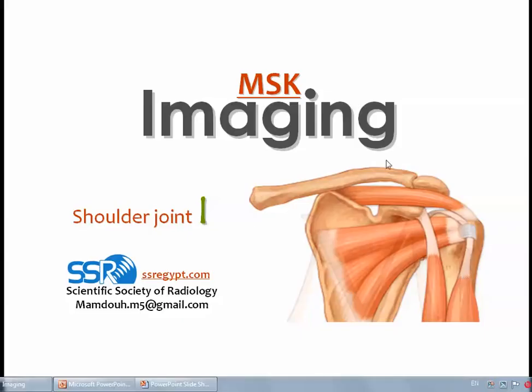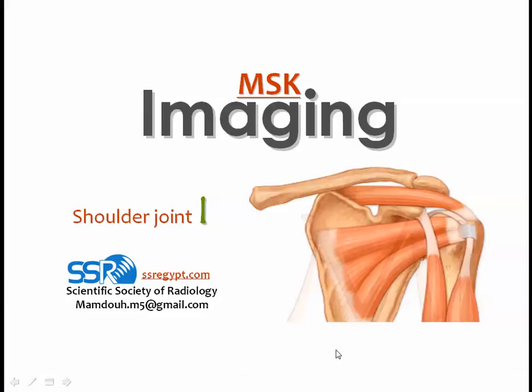Dear colleagues, in this talk we'll handle one of the important issues in musculoskeletal imaging, which is the imaging of the shoulder joint. Imaging of the shoulder will be handled in 3 talks, starting in the first one with the normal anatomy and techniques. Then we will handle the imaging of the rotator cuff and the impingement syndrome. And in the last section we will handle the instability and SLAP injuries.